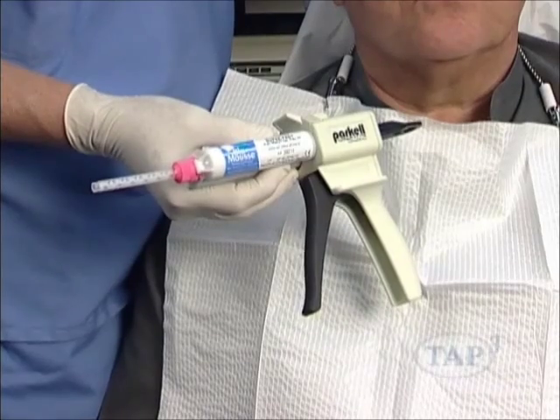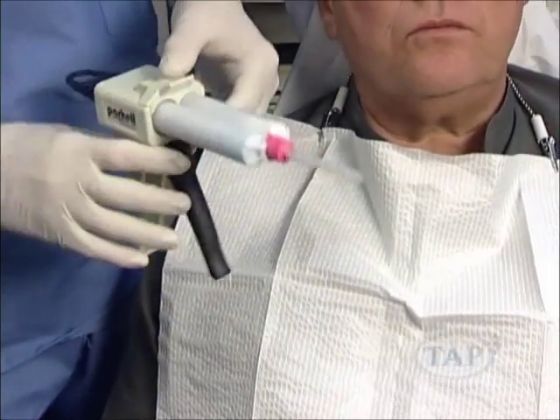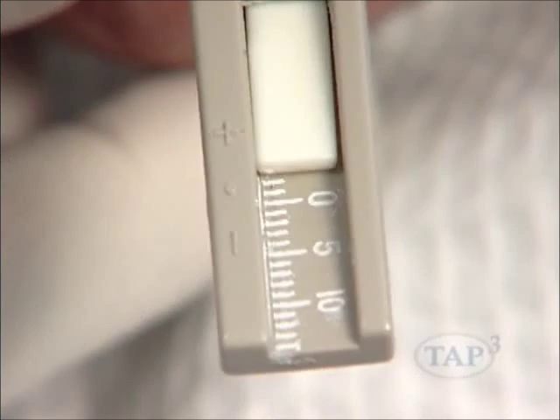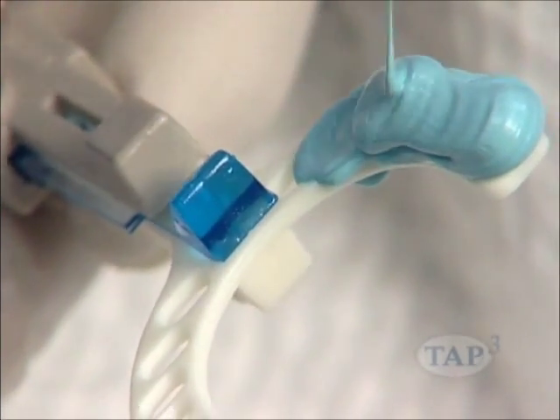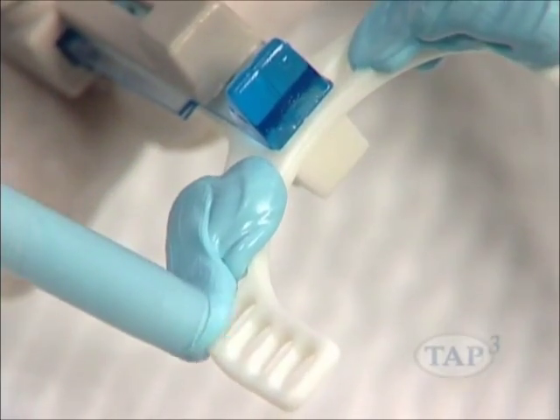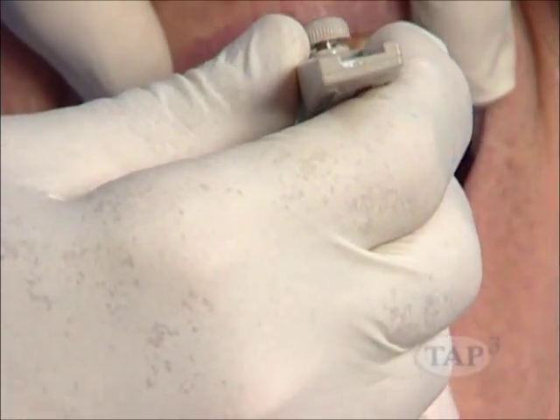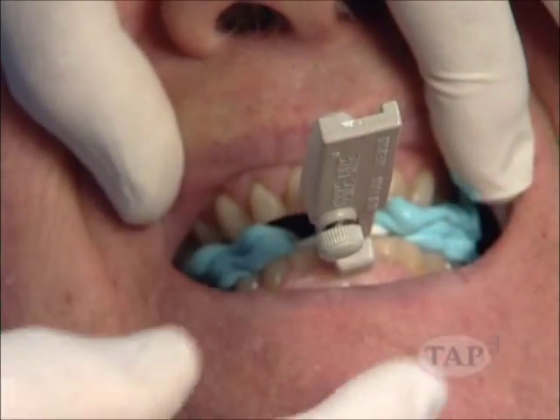The second bite registration technique is to use blue mousse registration paste. Use the George gauge at the same predetermined protrusion, 50% of maximum protrusion. Squeeze the mousse paste onto the bite fork. Place it in the patient's mouth and fill in the gaps between the teeth with the mousse paste.